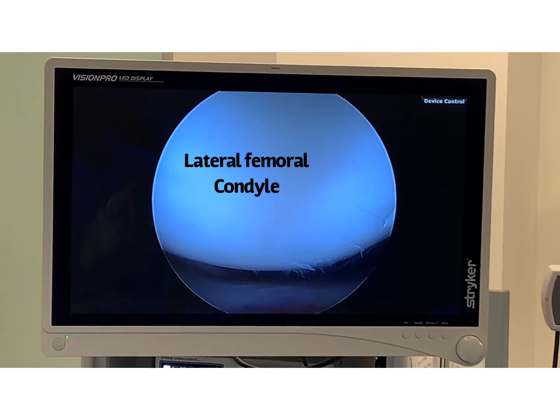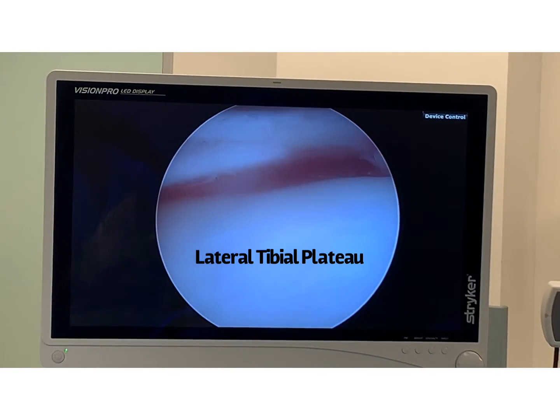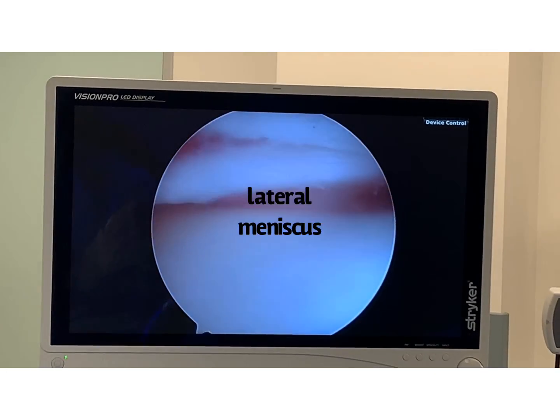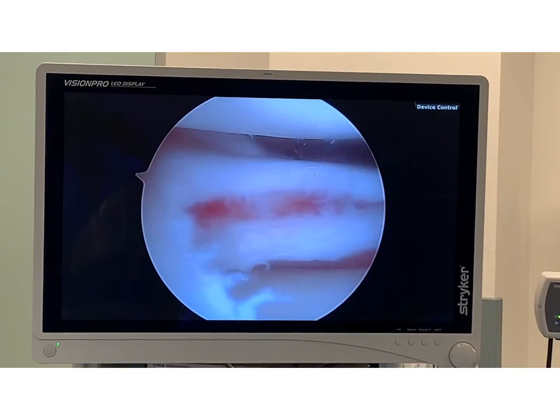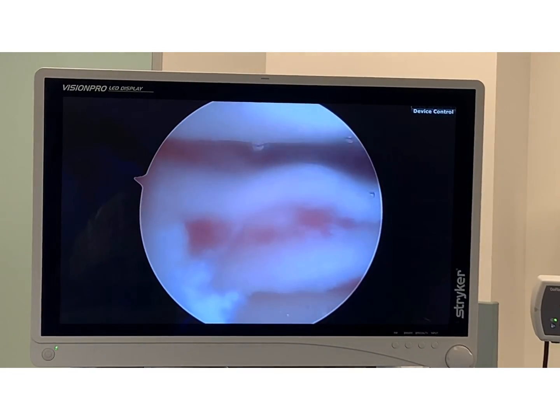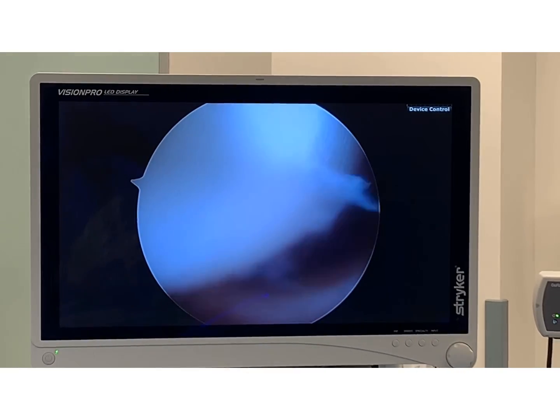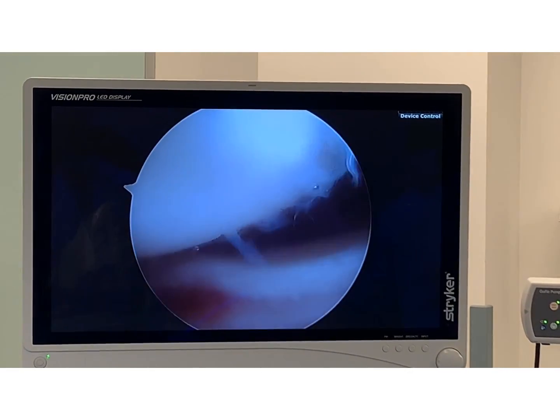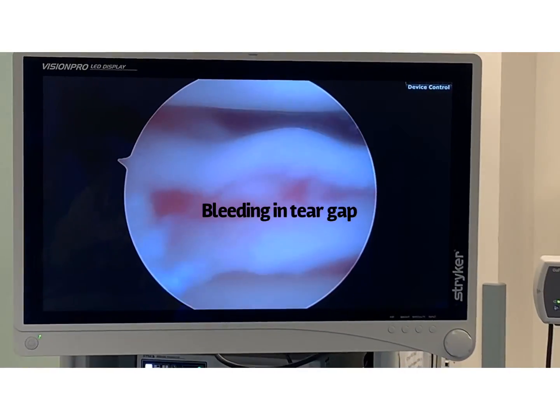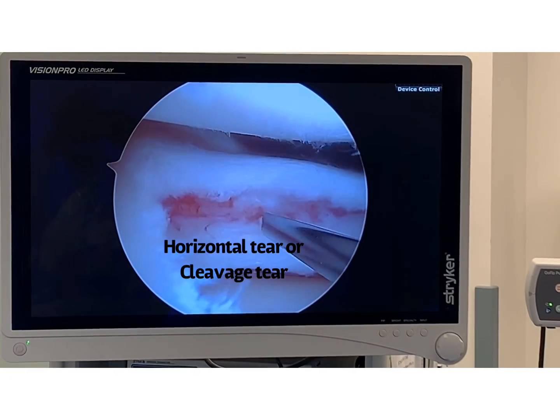We have the distal femur, the lateral femoral condyle, and the lateral tibial plateau. It's called a plateau because it looks like a mesa or a flat area. The lateral meniscus is right in here. I'm going to flush out this area really quick. I've actually already started to work on this meniscus tear. It's called a cleavage tear because it's a horizontal, long horizontal type tear.